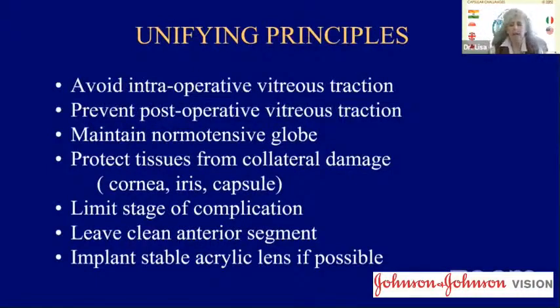We're limiting the stage of complications, and I think it's our goal to leave a clean anterior segment, not necessarily to deal with any lens material that falls into the posterior segment, but rather to do anything we can to get it out of the posterior chamber into the anterior chamber to remove it. And once it's there, at least in the U.S., where retinal three-port vitrectomy and lensectomy are available, I think it's important to leave it. Our goal would be to implant preferably a stable acrylic lens, but better to leave it aphakic than to end up with a cloudy cornea where we can't follow the retina.